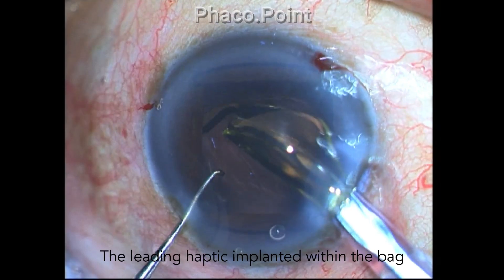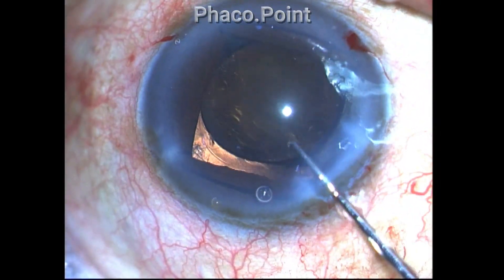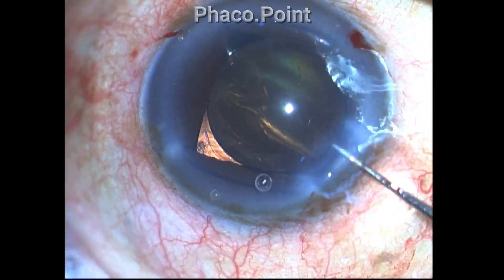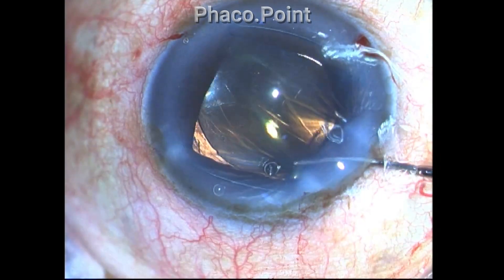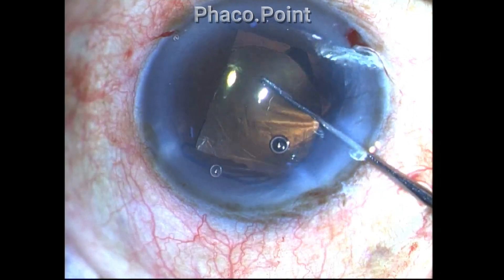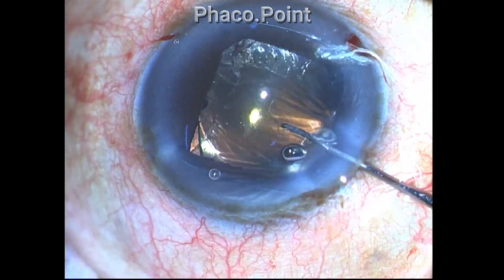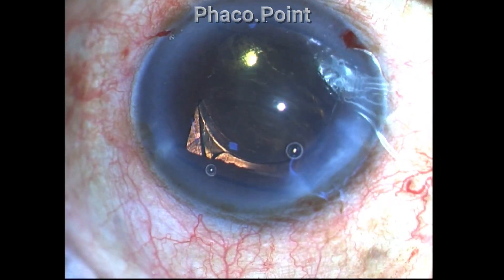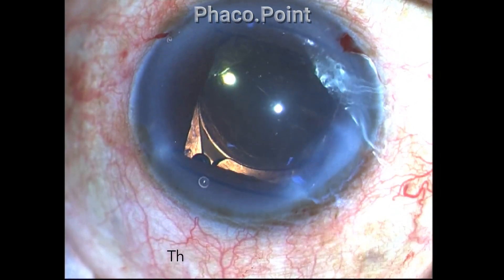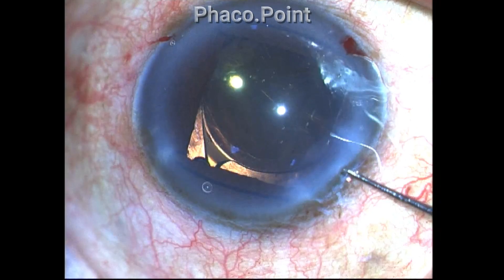Since I had successfully performed the posterior CCC, I decided to implant the IOL directly within the capsular bag. I am trying to dial the lens into the capsular bag. I thought I was successful and the lens had settled, until I noticed that probably the entire lens is not in the bag because of the squaring of the capsular rexis.